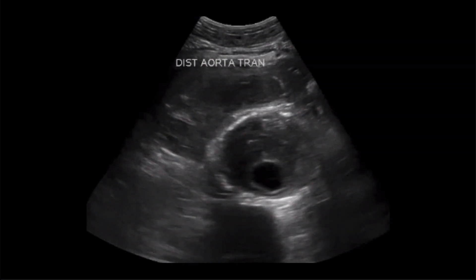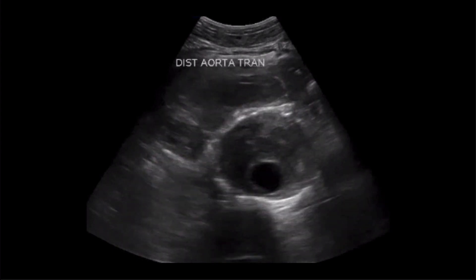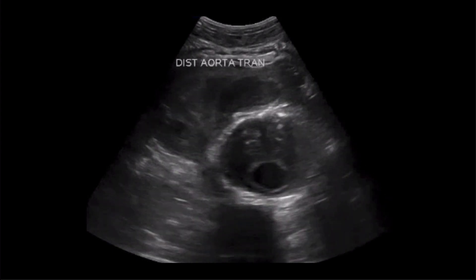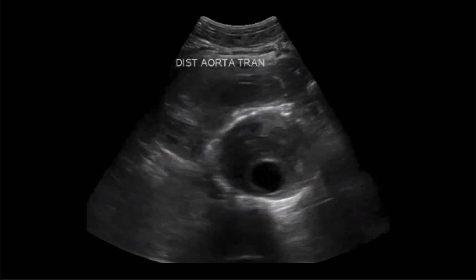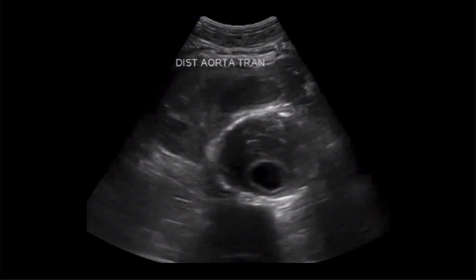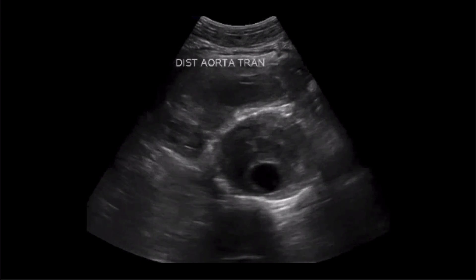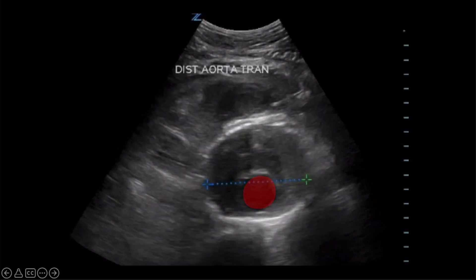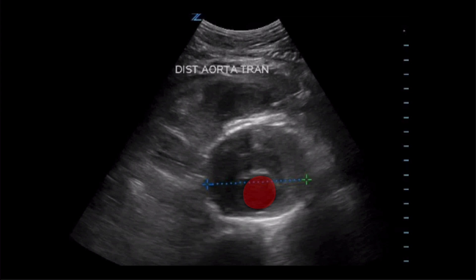Here is one of the first images obtained. Given the label placed by the scanning physician, there shouldn't be a question about the structure being imaged. Take a second to look at this clip and interpret the image based on the presenting complaint. What I want to make sure is that everyone is able to correctly identify the aorta. The red highlight does not represent the entire aorta, just the lumen.